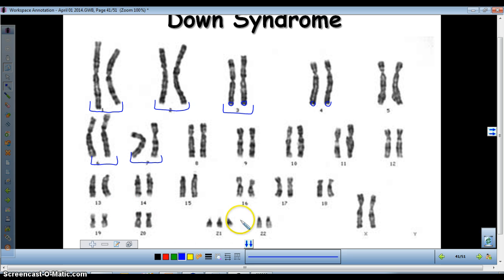But wait. What do you see here? Three copies of chromosome 21. Trisomy 21 is Down syndrome. It's a genic disorder.